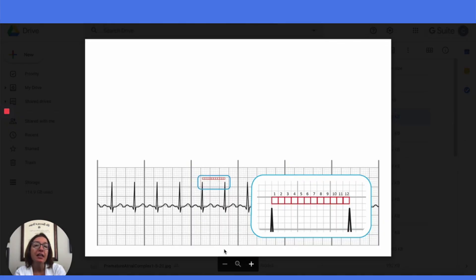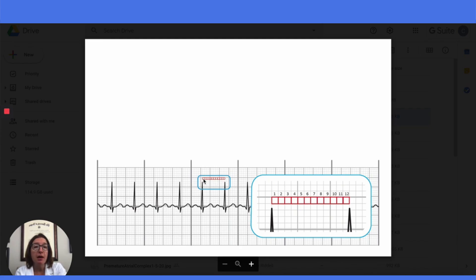Now let's talk about how to calculate the heart rate. If the rhythm is regular, the best way is using the small box method — again, just for regular rhythms. You would count the number of small boxes between the R waves. You can see it's blown up here, and we can count 12 small boxes between the R waves. Then you would take 1,500 and divide it by the number of small boxes between the R waves, and that will give you the heart rate in beats per minute. There are 1,500 small boxes in a minute, so 1,500 divided by 12 equals 125 beats per minute.